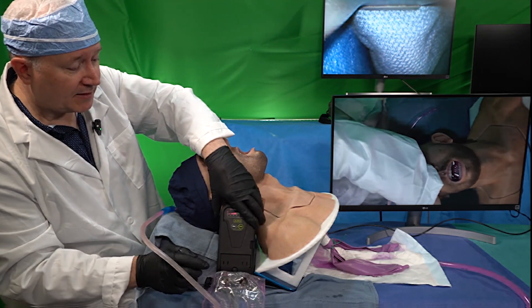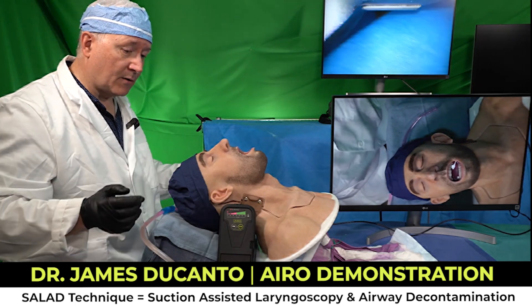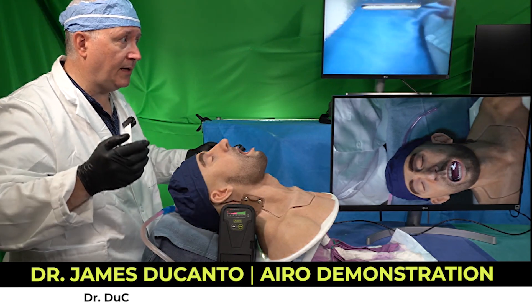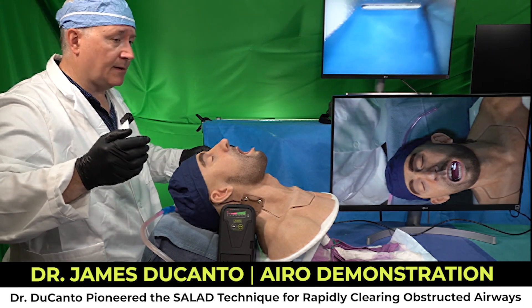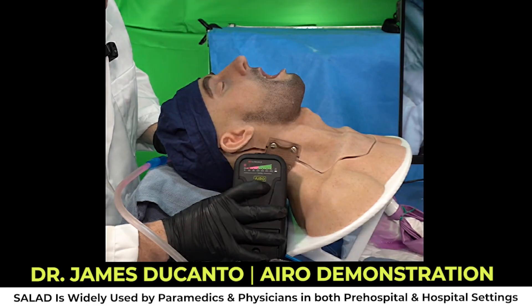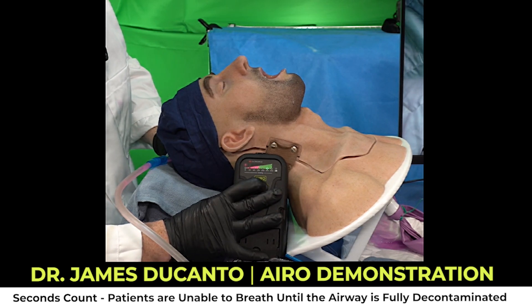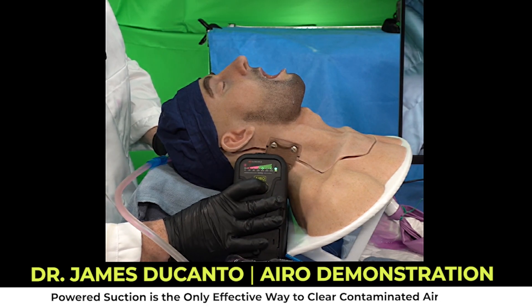I'm going to go ahead and put my unit down and examine my airway. You're going to notice that we have a completely contaminated airway, so we're going to perform what's called the SALAD technique. I'll begin suctioning the airway by activating the Aero unit and powering it up at 500 millimeters of mercury.